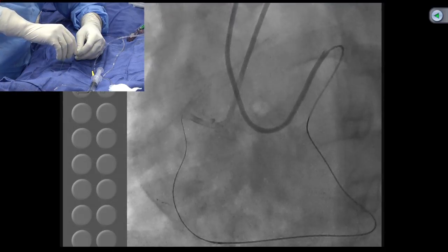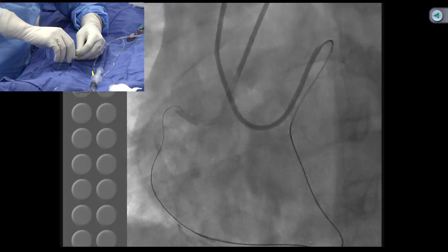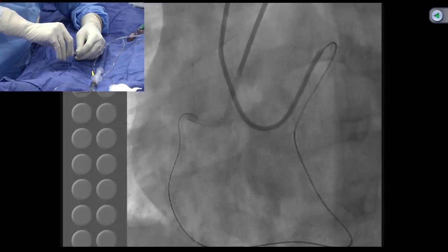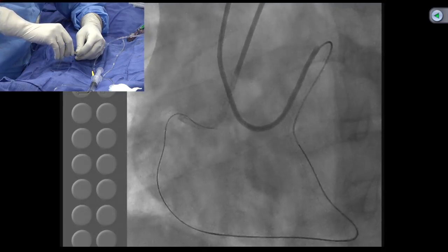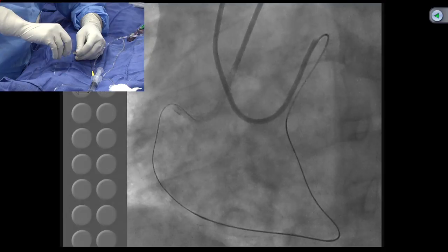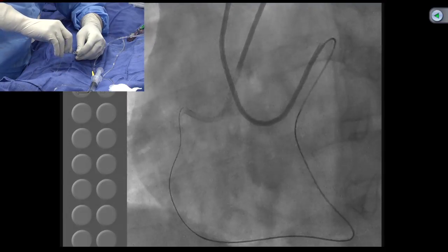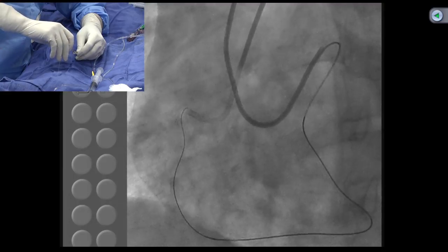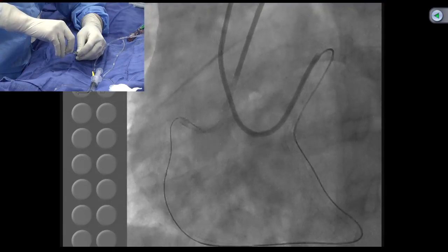But see, now it is not going to make a turn into the guide. Okay, you can leave it there. That's the whole purpose. We don't need to get too crazy about having to exteriorize and go inside, although this wire has gone very easily. No, it's not there. It's outside. As long as your Corsair goes through, this will be okay. You'll go easy with the antegrade. The other thing, to get the Corsair in, what you can do is, I think you are not in there, right?